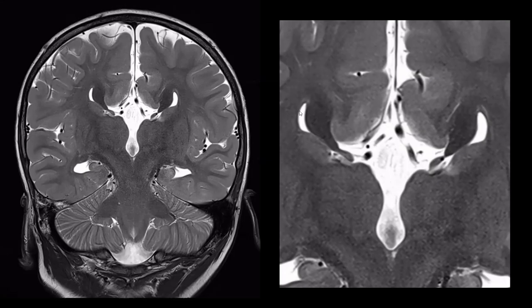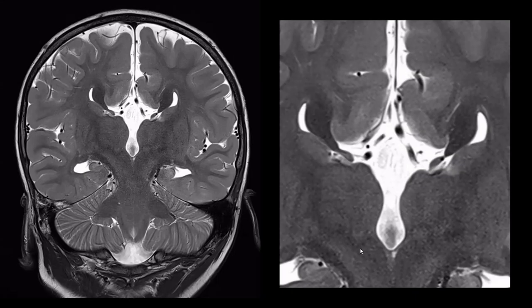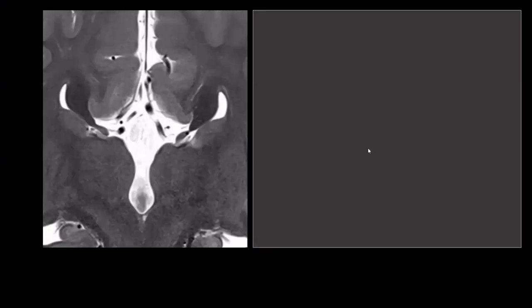The two white matter bundles visible here should normally be connected to one another as the corpus callosum. Because there is no corpus callosum, white matter has developed into two thick bundles running medially to the lateral ventricles, causing this bizarre morphology. These are called the Probst bundles — essentially axons that want to cross the midline but cannot, and so run medially of the lateral ventricles.